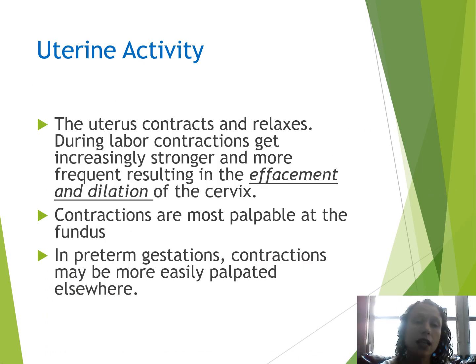So ideally, we're looking at contractions to see, are they doing what they're supposed to do? This is a review, I know, but are they dilating her cervix? Is she effacing? What's important to remember is that the toco doesn't measure how strong the contraction is. So what's the only way we can really tell if the contraction is strong or not? With our hands. Obstetric nurses know this.